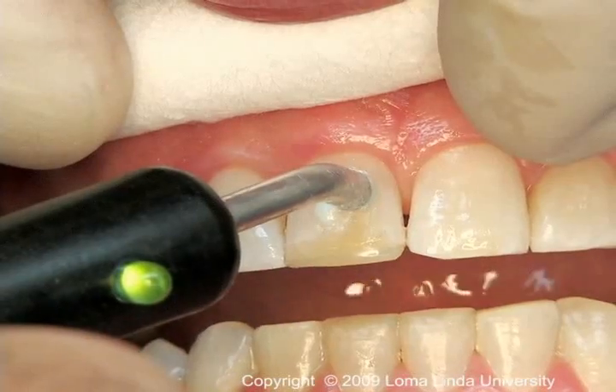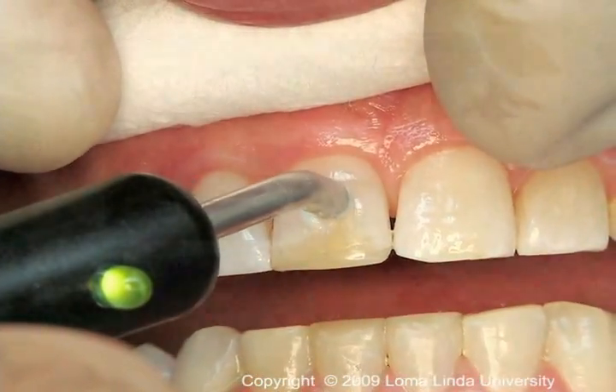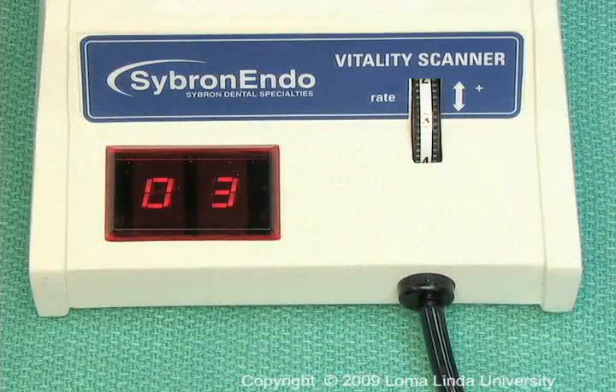Using a lip clip or having the patient touch the metal handle completes the electrical circuit, and the level of current gradually increases until the patient detects it.